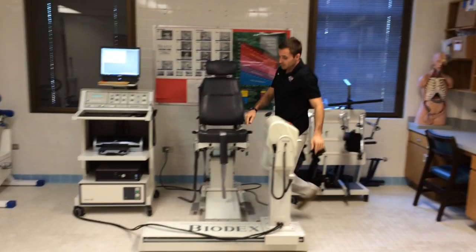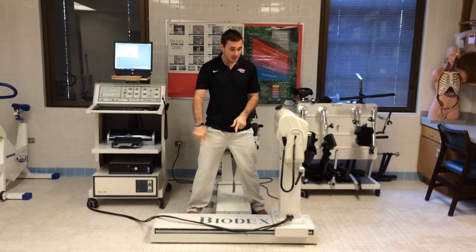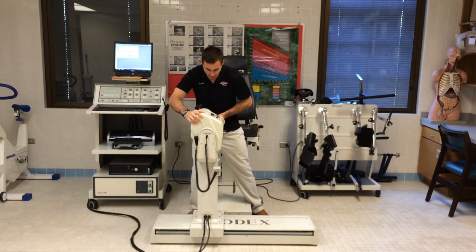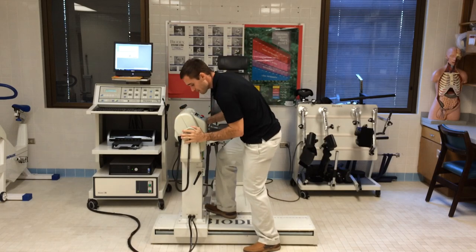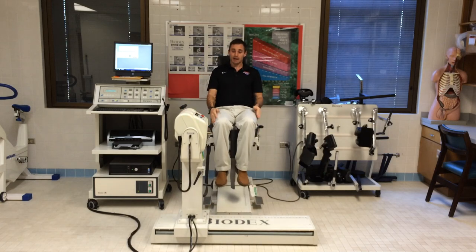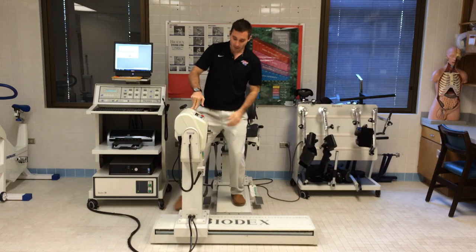From here, there's little steps on either side. By stepping on these steps, we can now slide this pretty easily. And if you're having a hard time sliding it, it's probably because you're not stepping hard enough on the step. We want to make sure it's there, get it locked in. That looks good. So now you can see if I was going to sit here, I'd be more aligned for my right side. So this is step one, making sure that we have this aligned properly.